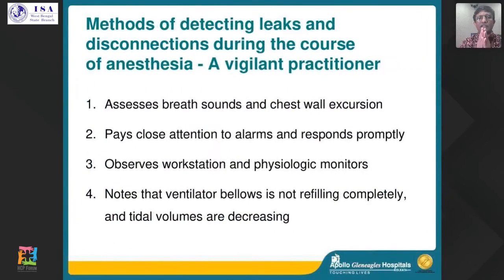So the vigilant practitioner is extremely, extremely important. Whether you assess breath sounds, you hear it, or you actually see chest wall excursions, you're paying attention to alarms. This is something that I keep teaching people when they first come into the OR: the alarms are ringing not for you to just go and switch them off. You see what is alarming, why it is alarming, make a diagnosis, resolve it, and then switch off the alarm.